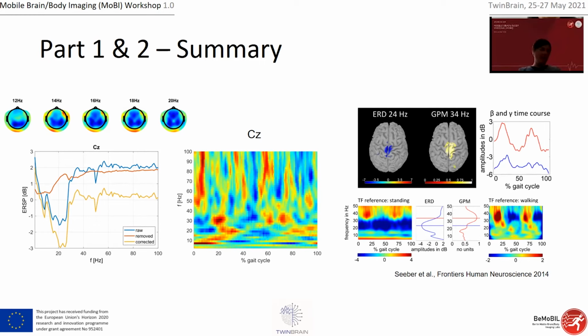I think not every participant is as beautiful as that. Some are more noisy, I believe. But if you have like 20, I hope to have something like this here. To be fair, this is also one subject, but here I was more stringent with cleaning, like manual cleaning in time, because here you can go fully automatic with minimal cleaning on the scalp, and it still somehow does the job. It gets better if you're more careful selecting bad components.